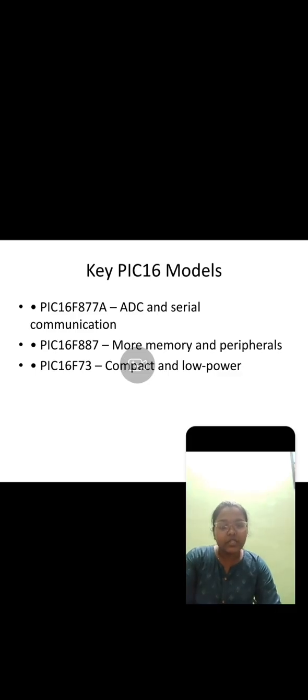It stores the value and does some basic calculations: is this glucose concentration lesser than the original, or, as the glucose level should be 80 to 120, does it come within this range, or is it beyond or below this range? It will do all of this.